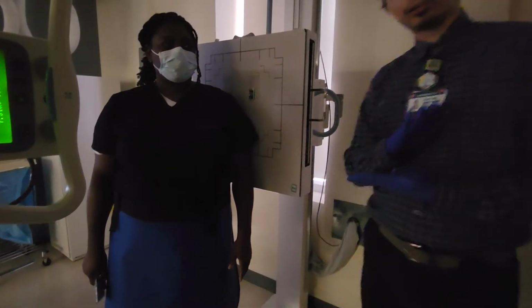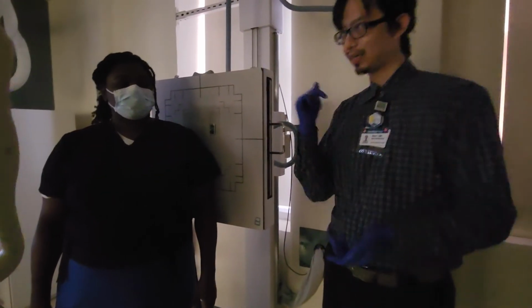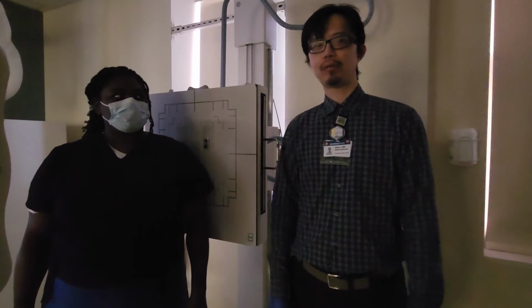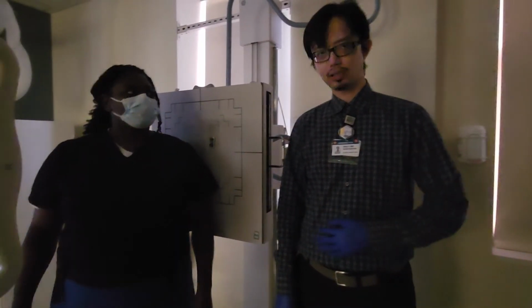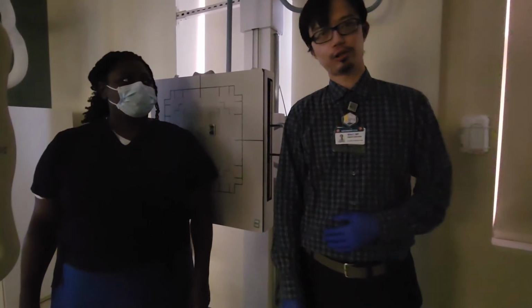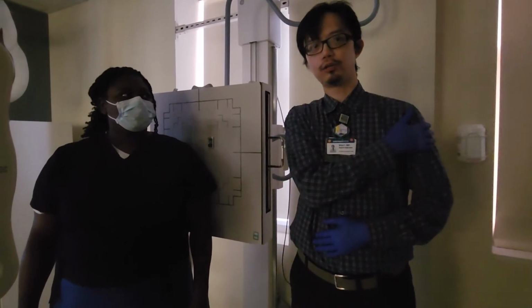Okay, once again, I'm going to warn you. Actually, let me give you a few more warnings. In clinic, when you do shoulders, right? Remember how we did the lateral humerus? How they do it like this, hand on the stomach, right? Not a true lateral. When they do internal shoulders, they do the same thing. They put hand on the stomach, not a true internal.